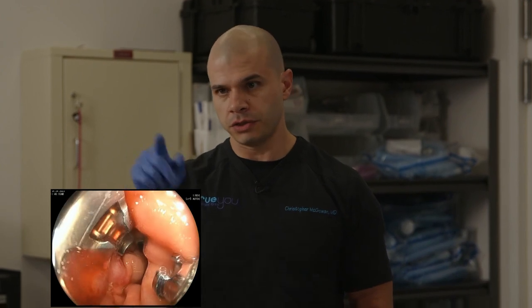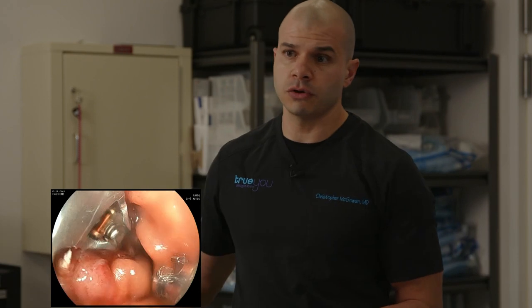And a lot of patients will ask us about durability of this procedure. One thing we know is that this is a very durable procedure. The amount of scar tissue that we're inducing internally with the APC and then the strength of the healing process that the purse string conveys means it heals exactly like that. And it is highly unlikely that it will stretch again, assuming that it's performed properly. So we know that the weight loss is durable. And so there's two benefits to this procedure.